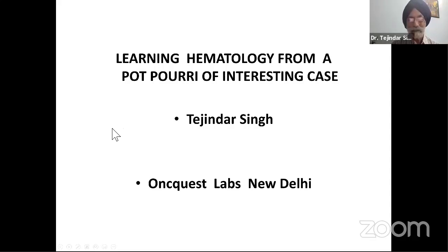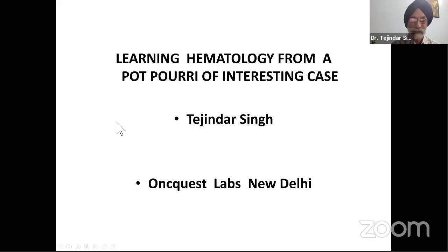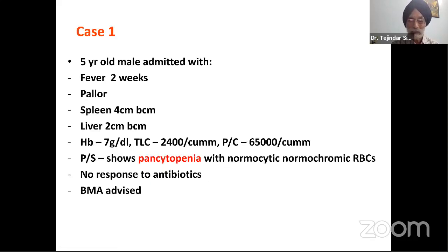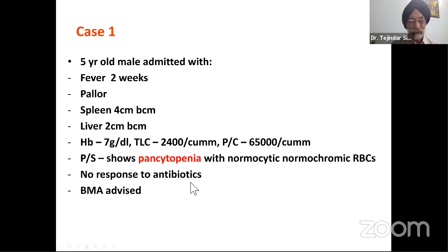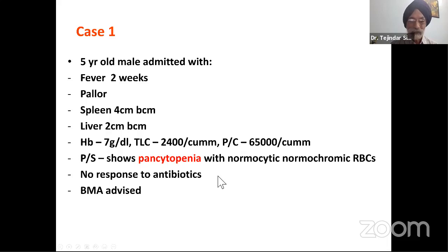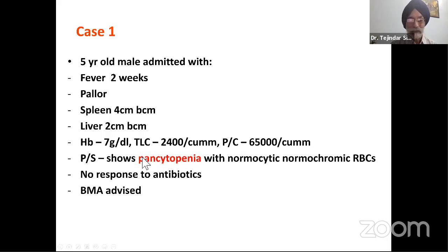I'm going to talk about a few cases which are diagnosed basically on morphology, and then how we should proceed with those cases to arrive at a correct diagnosis. Starting with case one, a five-year-old child admitted with fever of two weeks duration. The child is pale, has both liver and spleen palpable, and has pancytopenia with hemoglobin of 7, TLC of 3,400, and platelet count of 65,000. The child is not responding to antibiotics, so a bone marrow aspirate was advised.